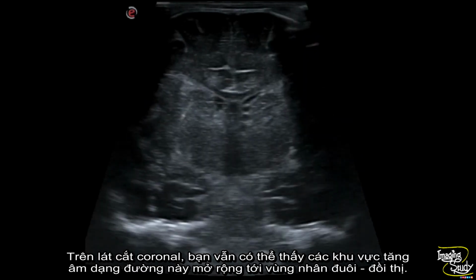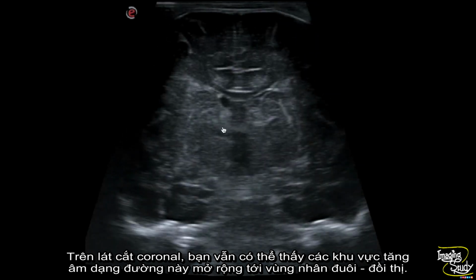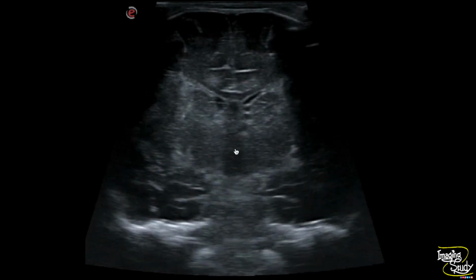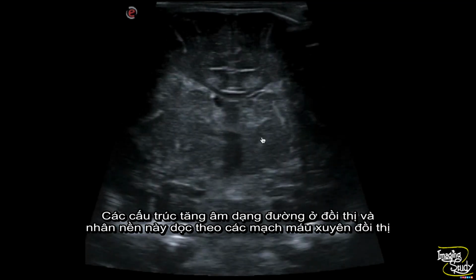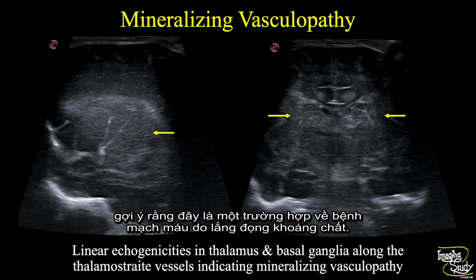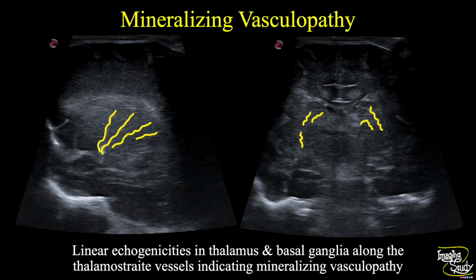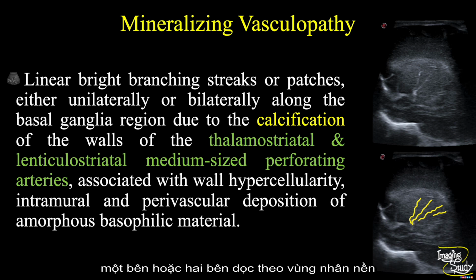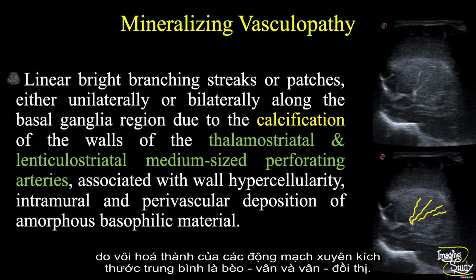Here on coronal section, you still can see these echogenic linear areas extending to the caudothalamic region. So these linear echogenicities in the thalamus and basal ganglia along the thalamostriate vessels indicate it as a case of mineralizing vasculopathy. In mineralizing vasculopathy, you will get linear bright branching streaks or patches either unilaterally or bilaterally along the basal ganglia region due to the calcification of the walls of thalamostriatal and lenticulostriatal medium-sized perforating arteries.